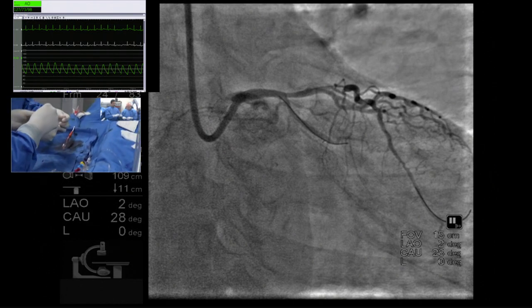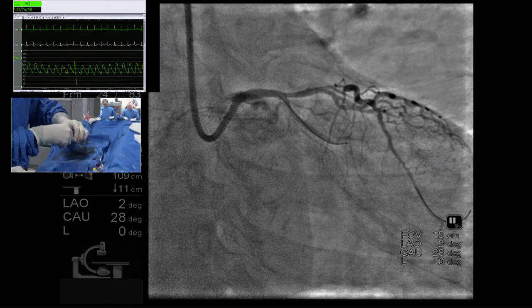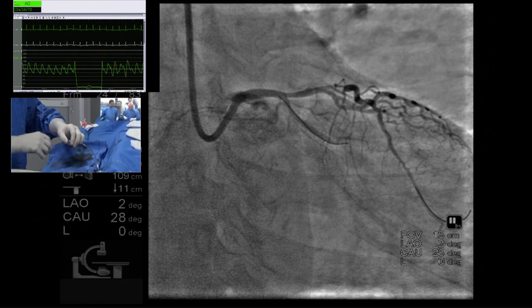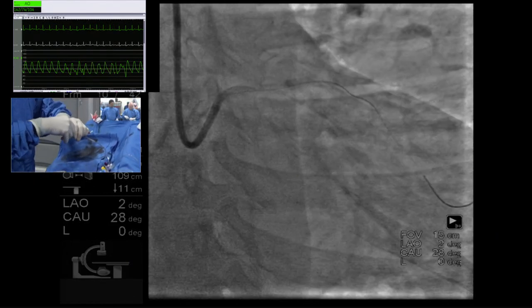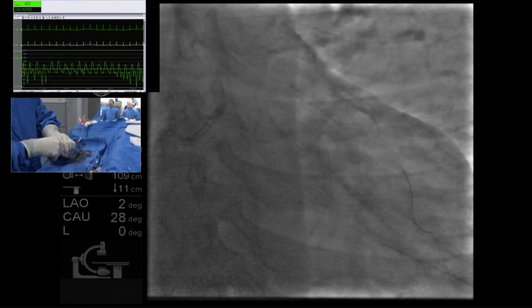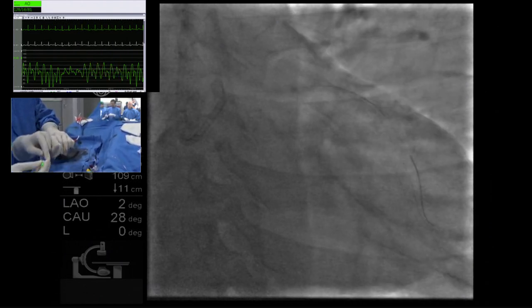We all look, but it's different when you touch. Absolutely. I do a lot of CTO PCI in my practice, and the Xion wire is my preferred wire to wire things like dissection planes because there's a visuo-tactile piece there. That wire will bend and give you visual feedback the moment it's hitting any sort of tissue. As a result, it becomes a very fine palpation instrument where it's less about physical feel, more about what your brain will interpret the wire behavior to tell you.